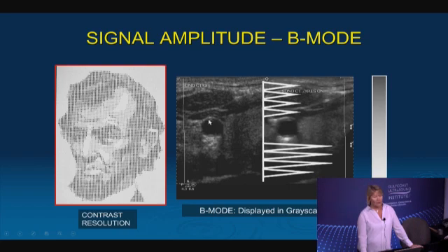So we often don't even see an echo, which is why it's assigned black. So when you look from the top wall of the carotid artery to the bottom, here, there's no spike because it's such a weak reflector. But then the sound wave continues traveling through, and it interacts with the back wall of the carotid. A different density and stiffness gives rise to a different spike, and then the structures beyond. So now what the system has is a series of spikes that are all different heights, and they're plotted at different depths. They're arising from different depths in tissue.